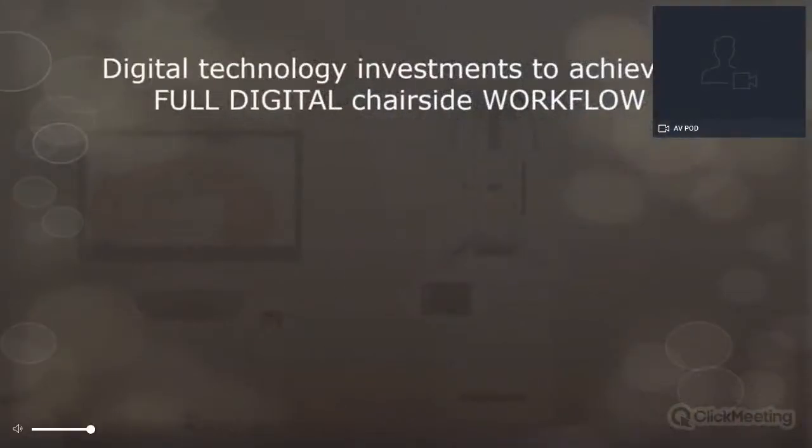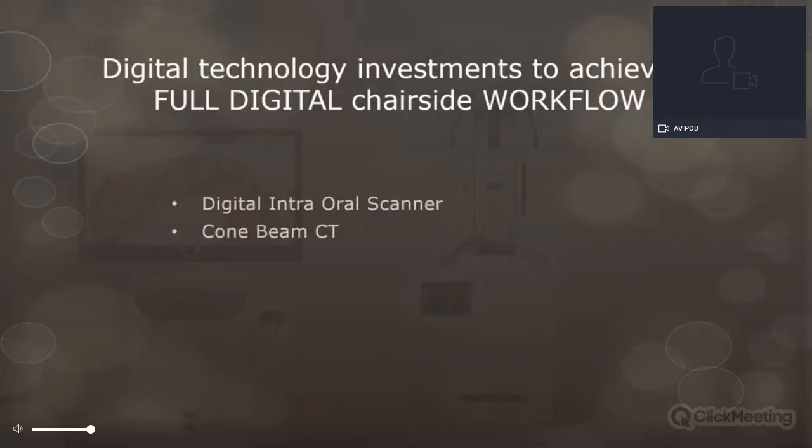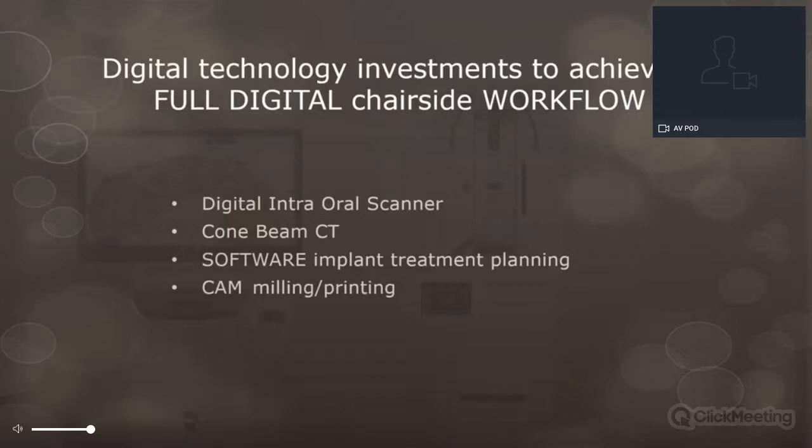What do we need to consider a full digital implant treatment workflow? Four components are required. The first is a digital intraoral scanner. Second is a cone beam CT. The third is a software which uses the two files from the intraoral scanner and the cone beam to help us and assist us in the implant treatment planning. And finally, the production, which is either CAM milling or 3D printing.